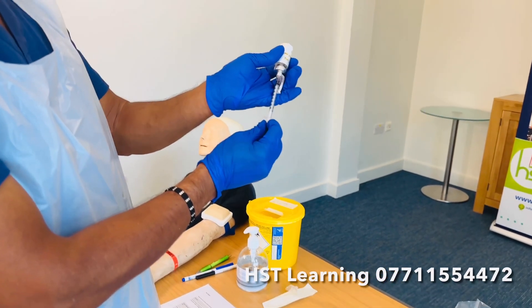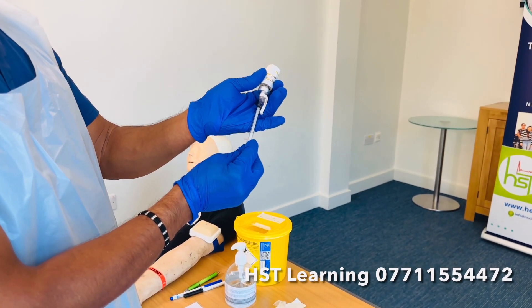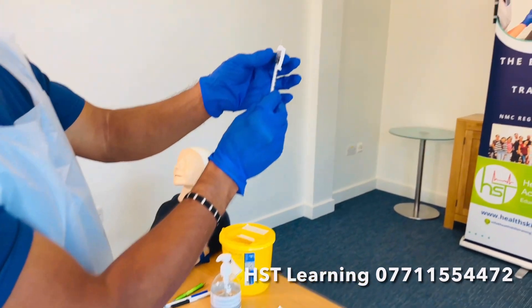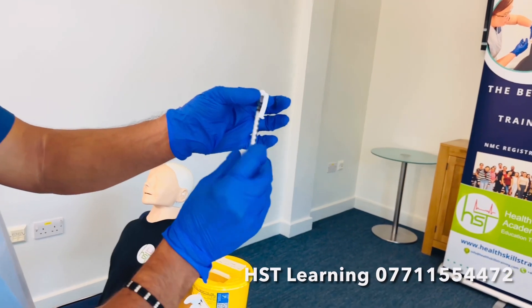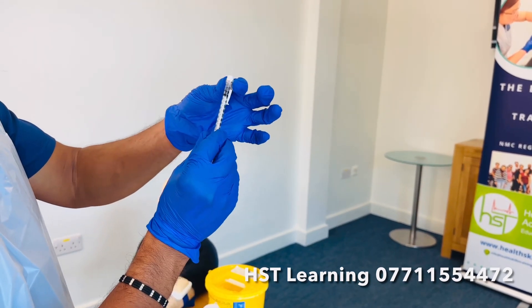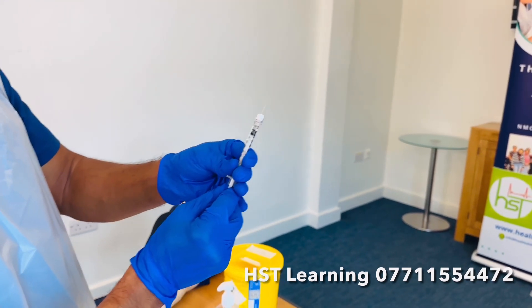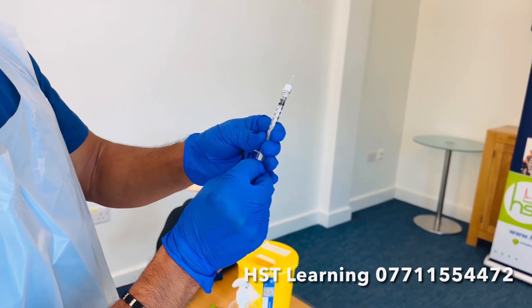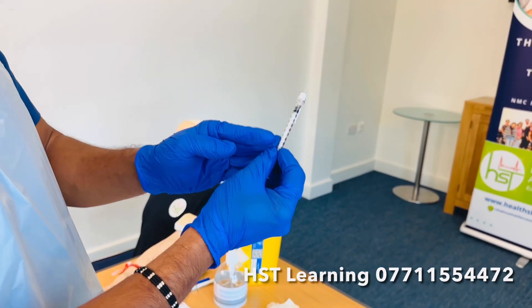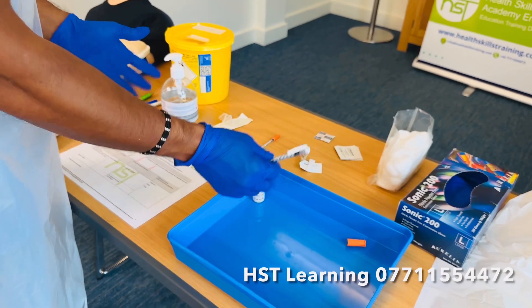Whatever units have been prescribed — whether 14 units or 8 units — let's say 14 units have been prescribed. Turn the bevel to read it properly, remove the air bubble, and bring it to 14 units. Hold it over the tray so any excess falls off. I've now got 14 units. Resheathing or scooping is not allowed once the medication is prepared.